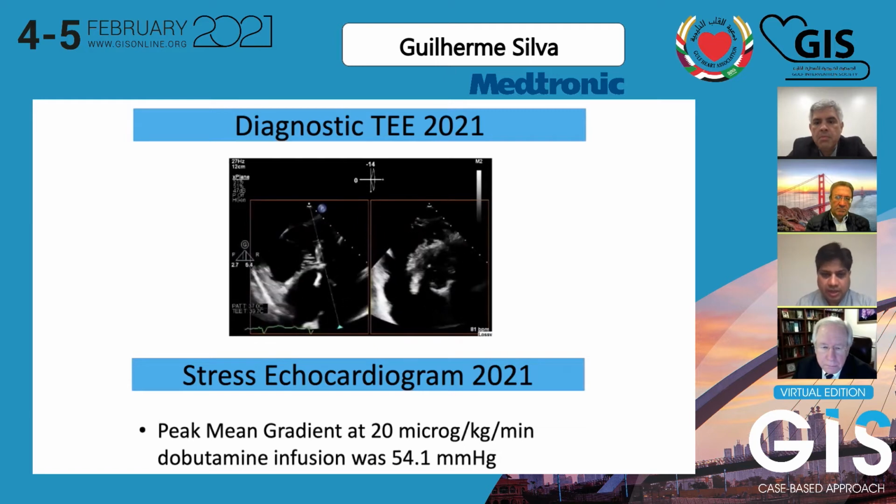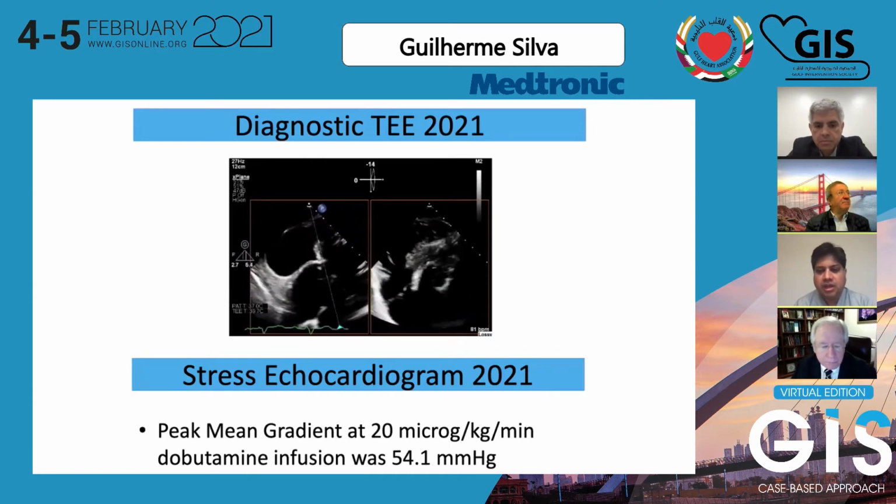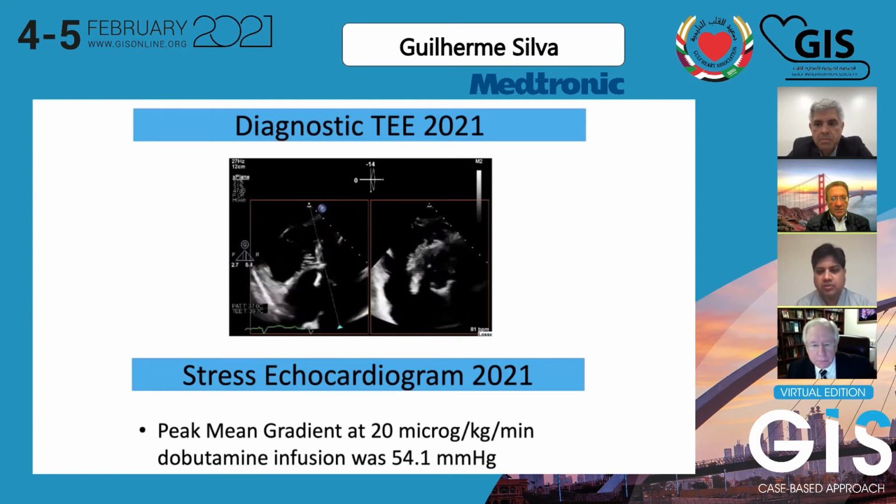And I was looking at the transgastric views again, it's very, very difficult to look at bioprosthetic valves, which are a little older, to see how good the valve excursions are. So in this particular case, you can see that the valves are opening well, but there is still some thickening. Then it clearly says that yes, there is some degree of aortic stenosis, with valve leaflet restriction. However, there is significant patient-prosthesis mismatch, that keeps your dimensionless index always less than 0.35. In this case, it's 0.31, which made us decide what we can do to lower that mean gradient and expand this valve.